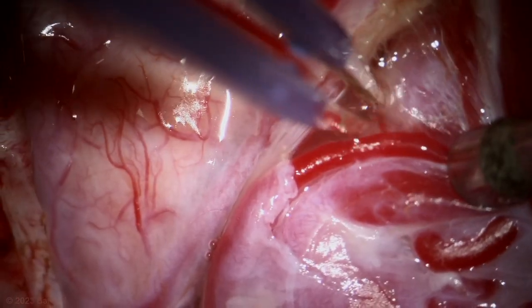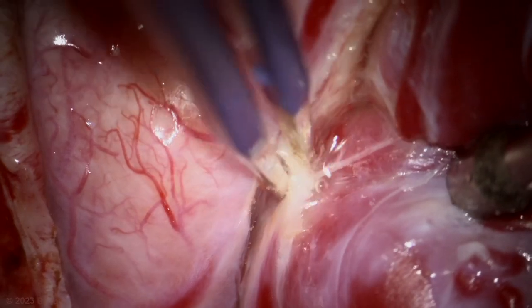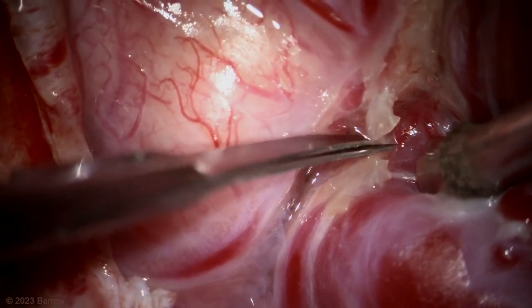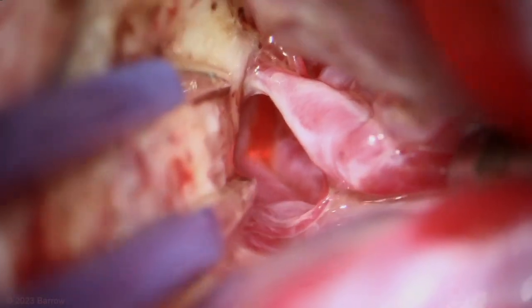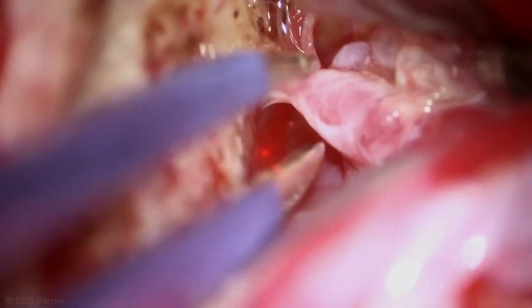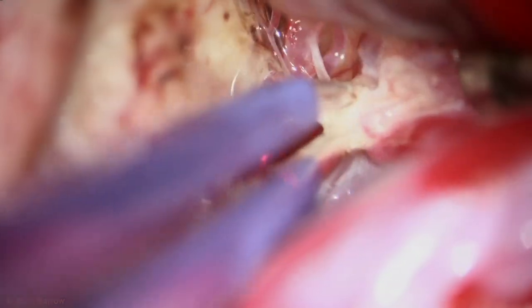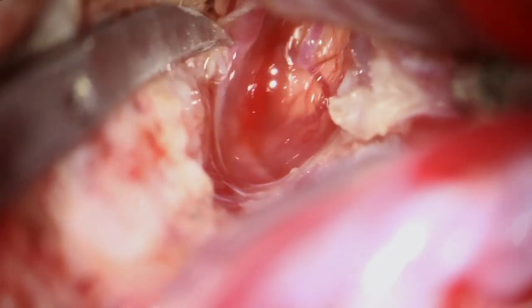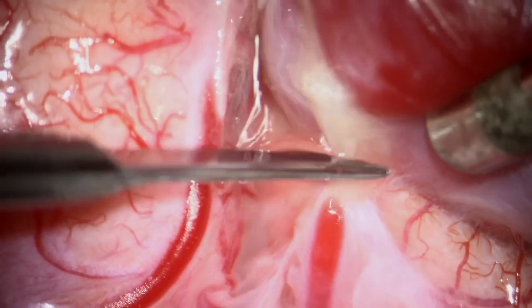I'm going along the posterior margin of the AVM right against this very dilated draining vein. The draining vein is much more fragile. It needs to be carefully protected, but by dissecting in this plane, you can see that it opens up this space underneath the vein where a lot of the feeding vessels are coming into the nidus. I'm lifting the vein with my sucker in my right hand, rolling it away from the cortex and developing this dissection plane.